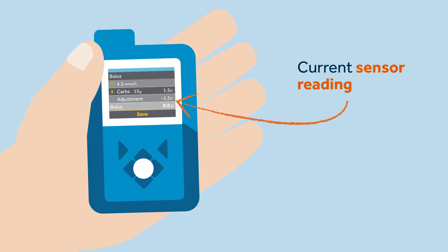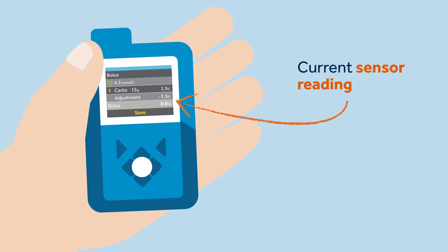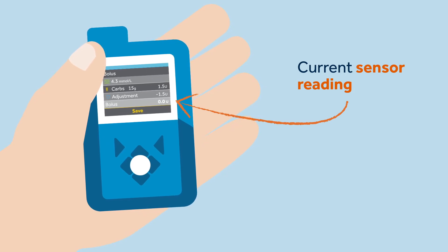The BG value will automatically appear on the pump screen. The BG should be confirmed on the pump by selecting yes. The meter BG will automatically be used on the bolus feature screen for the next 12 minutes.